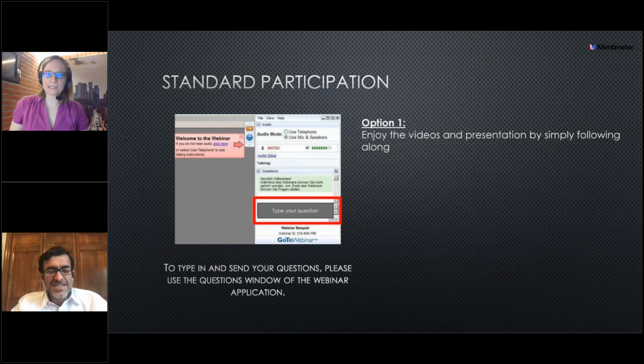You said in one case that you can repeat the laser, and the question was, how often can you repeat the laser, and what would you see as the minimal time interval between two laser sessions? This is a very important question, and that is where I really put microsecond laser much higher over PDT, because we are always afraid of repeating the PDT, but with microsecond laser you can very comfortably repeat it. I would usually wait for 2.5 months to understand the response, and if I am not satisfied, you are really very comfortable in repeating the microsecond laser.